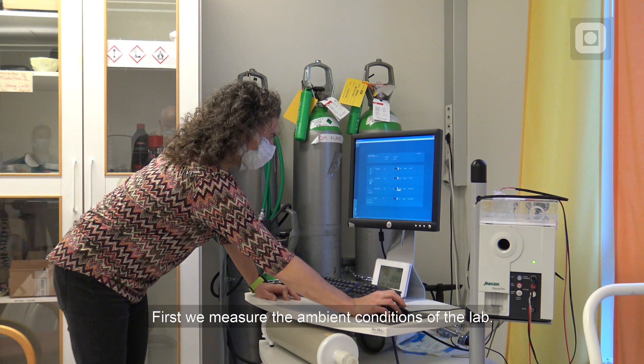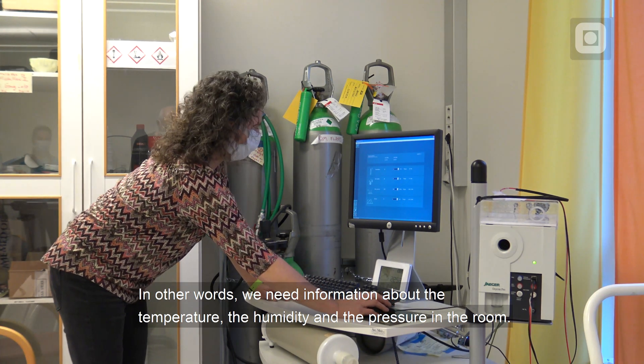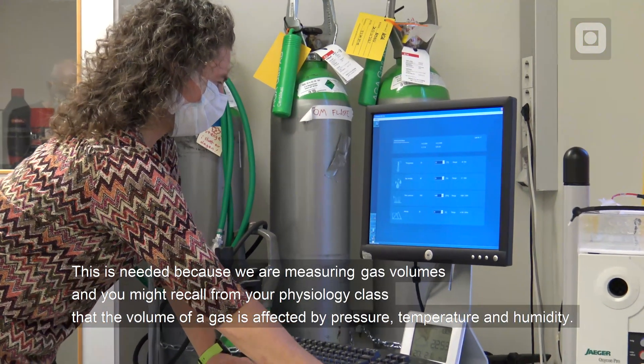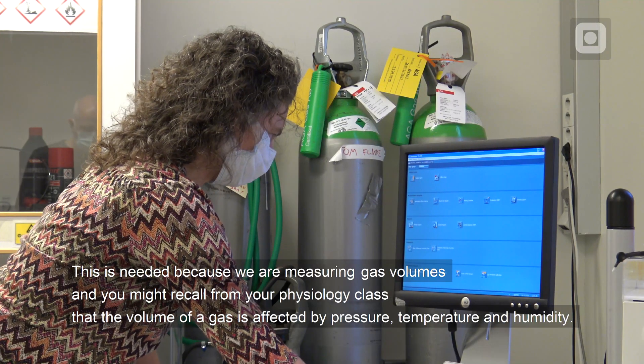First, we measure the ambient conditions of the lab. In other words, we need information about the temperature, the humidity and the pressure in the room. This is needed because we are measuring gas volumes, and you might recall from your physiology class that the volume of a gas is affected by pressure, temperature and humidity.